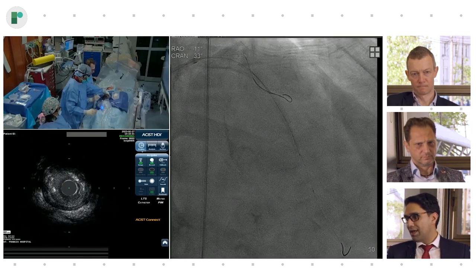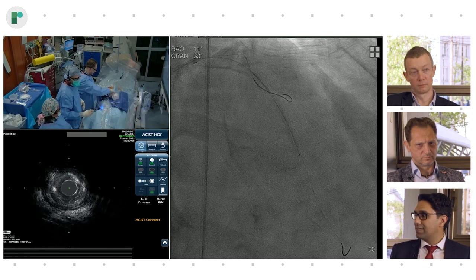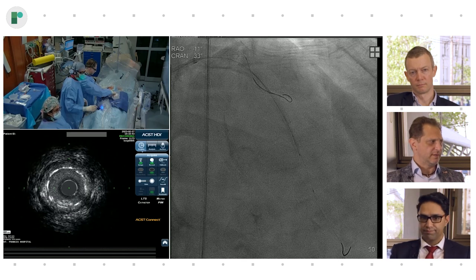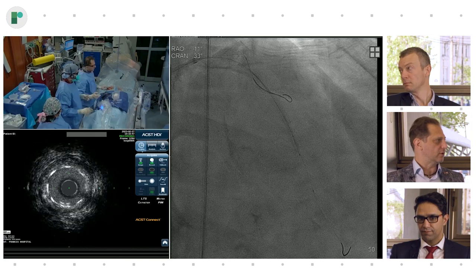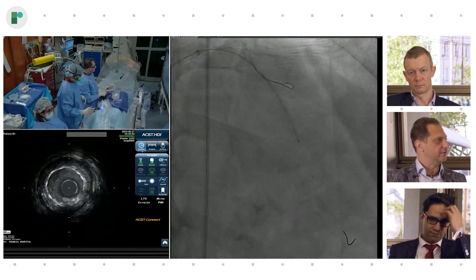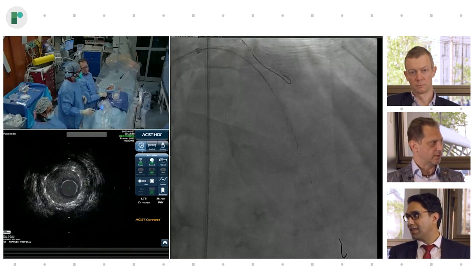We'll go back with the Navvus catheter, and that'll help us decide if there's a focal step up in that segment, then clearly there's a dissection flap that's causing the problem. But if it's diffuse all the way throughout, then it might not be the same issue. Well, the other thing also, I think, in especially a case like this, you can't be overly dogmatic. The plan was to do this with zero contrast, but now you have a potential complication. And so now you have to invest a bit of contrast to know what's going on. And that's why we stage, because we've got 18 milliliters more than we did last time.